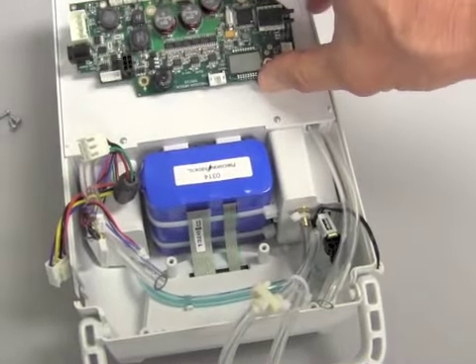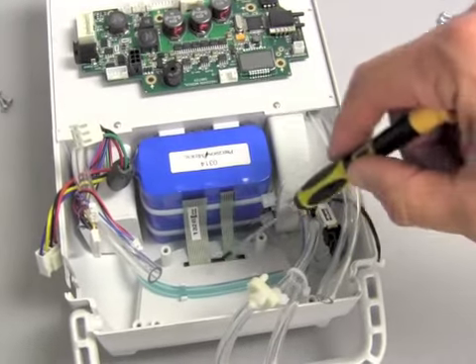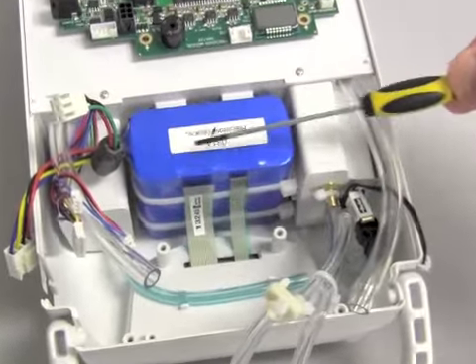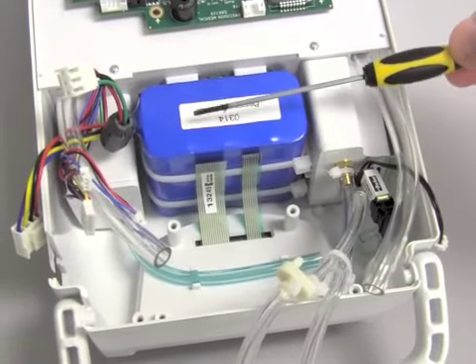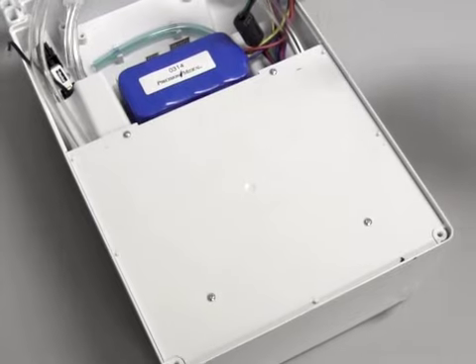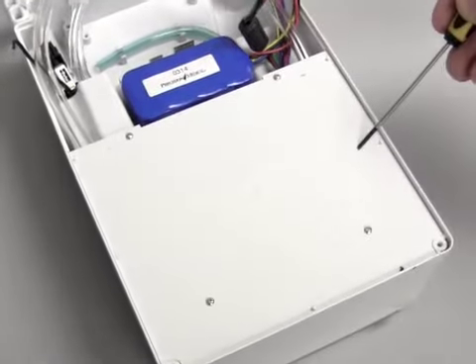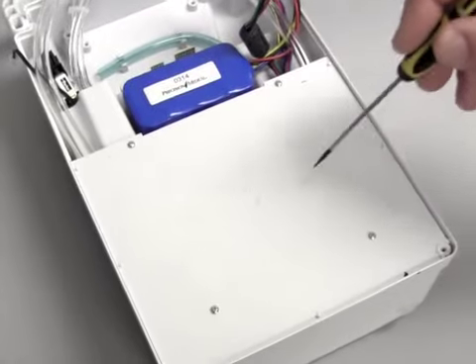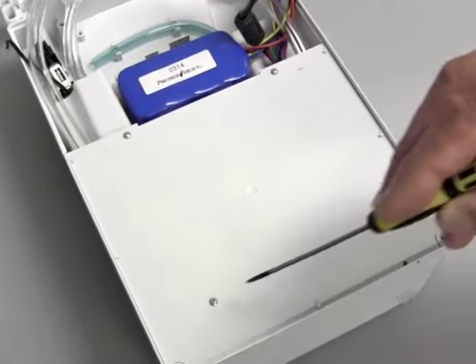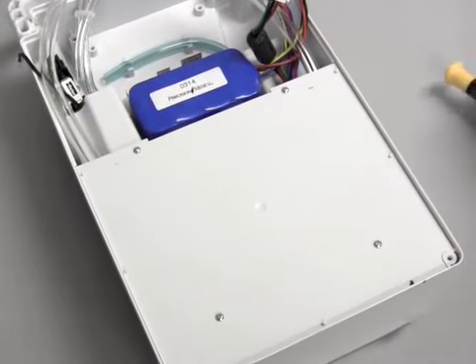This shows that the circuit board has been removed, and it also shows that the ribbon cables that come from the control knob are sitting against the battery, ready to be reassembled in the future. The next step for disassembling the POC is to remove the plastic plate that covers the compressor housing. There are 4 Phillips head screws that have to be removed before this can be done.